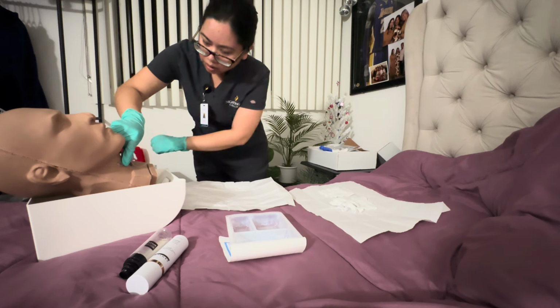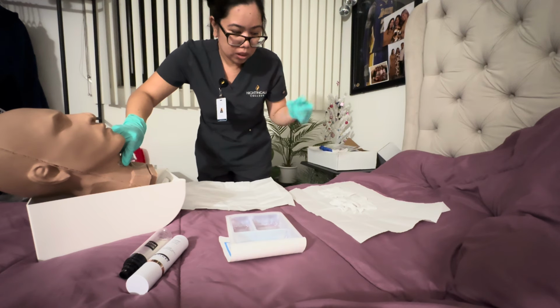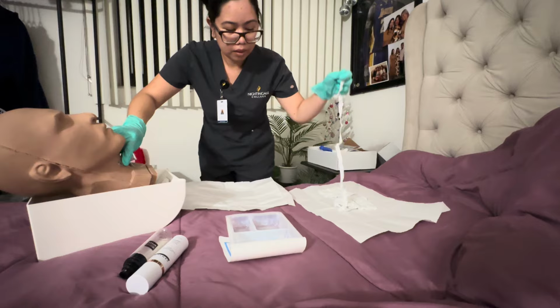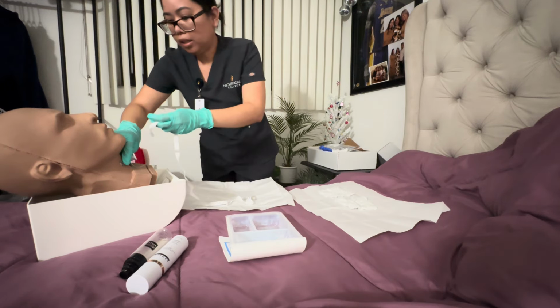okay, and then you're gonna discard it, and then you have to get the new tie. So we're gonna get the new tie.